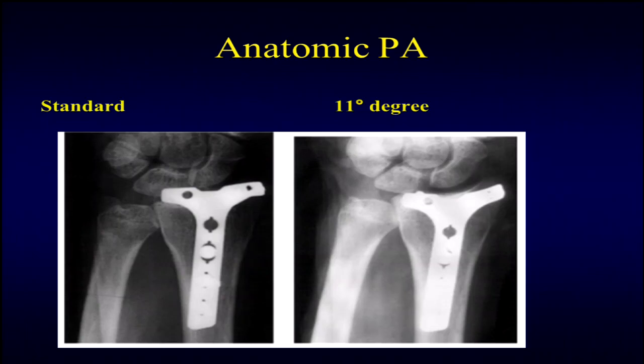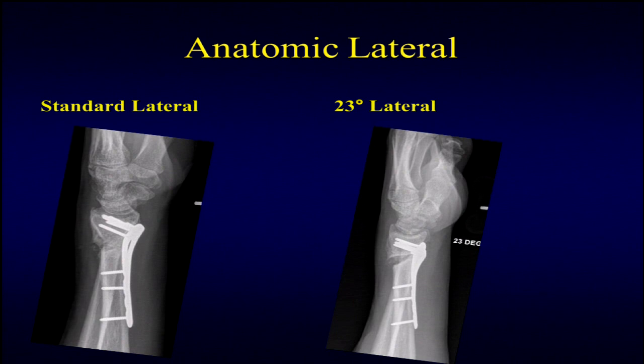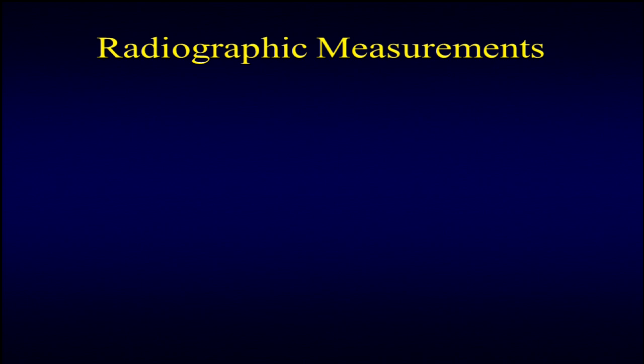On the left side you see a standard film from Gelberman's article showing a dorsal plate that looks distal and almost in the joint on the standard view, whereas once you shoot down the joint at 11 degrees you can see nicely down the joint. With your standard lateral it's hard to see whether screws are penetrating. This is a patient I did a distal radius osteotomy on—having that tilt shows the curvature very nicely to ensure there's no penetration.